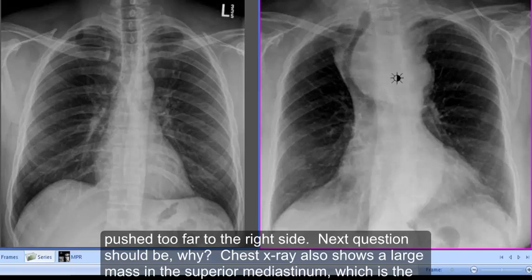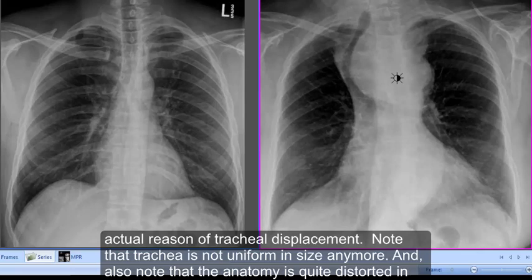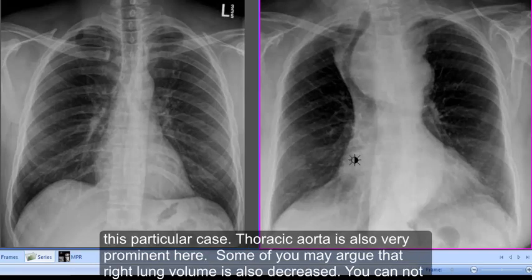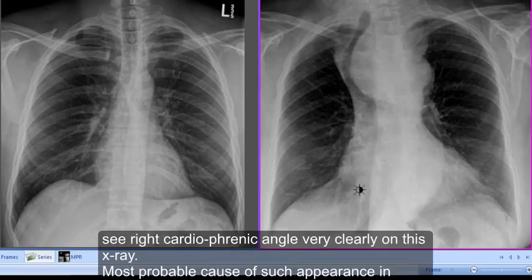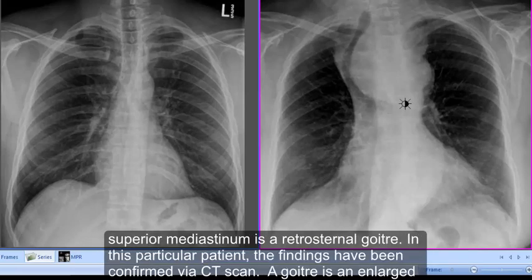The chest x-ray also shows a large mass in the superior mediastinum, which is the actual reason for the tracheal displacement. Note that the trachea is no longer uniform in size and the anatomy is quite distorted. The thoracic aorta is also very prominent here, and the right lung volume appears decreased — the right cardiophrenic angle is not clearly visible.